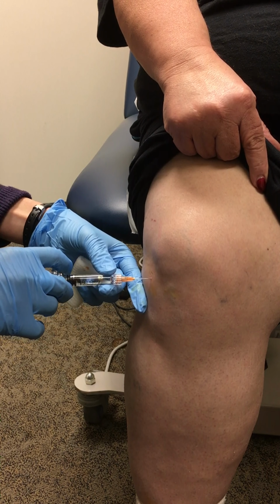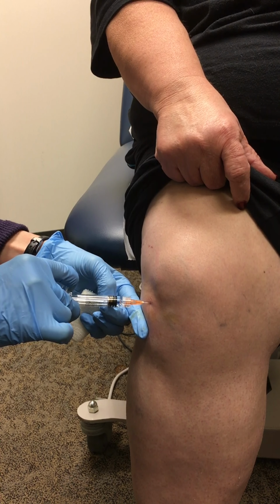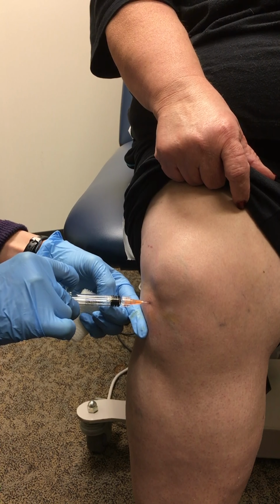So I was getting a little bit of resistance. So you saw how I just redirected the needle a little bit until I got a nice smooth flow of the viscosupplementation. Sometimes if you're up against the femur bone a little bit, you'll get some resistance. So then just by redirecting slightly, I got a nice smooth flow. So you shouldn't have much resistance at all, and the patient should just feel a little bit of pressure. They shouldn't feel a sharp pain.